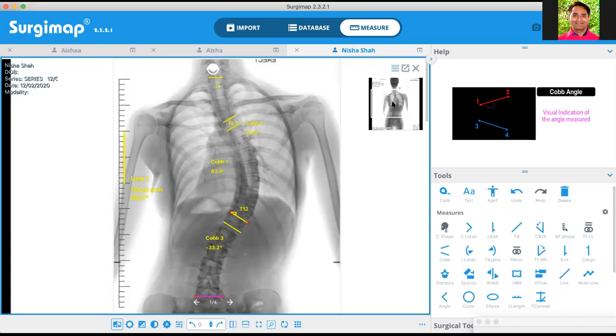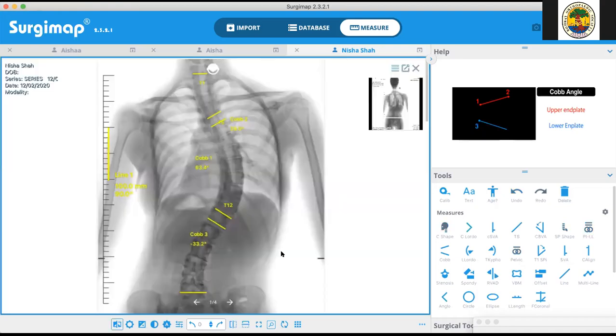Okay. I just wanted to know if there is any recommendation from SRS. In the manual there were none. You measure at the end of your curve. So this is the colloquial SRS definition. When you talk to any of the SRS surgeons, this is the colloquial definition they give. This was told to me by Lenke. This is how Lenke defines a fractional curve: apical and end the same. And then he does not mean the end vertebra as we define the end vertebra. It's the end of the spine. Yeah, because we always have hemicurves at the ends, not in between. So it has to be at one of the ends.